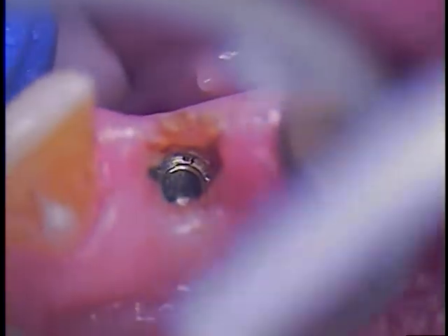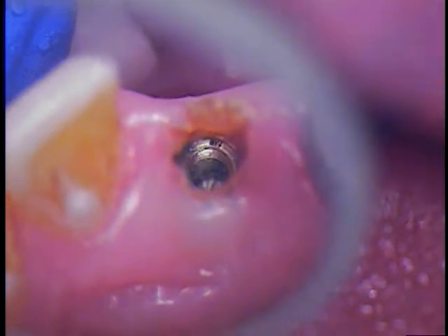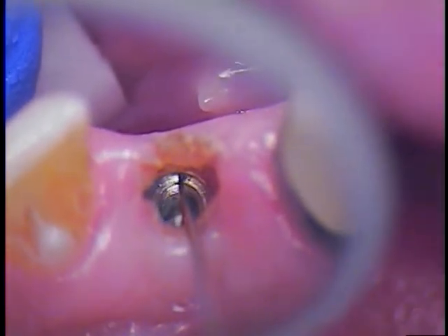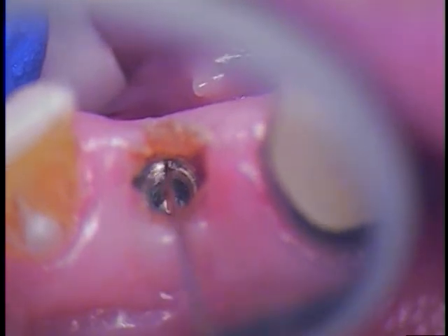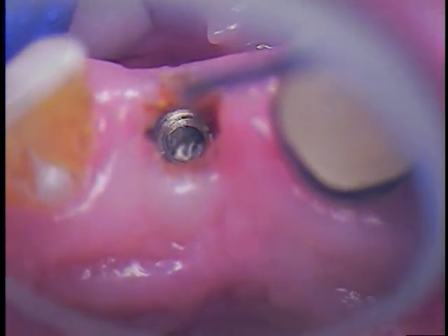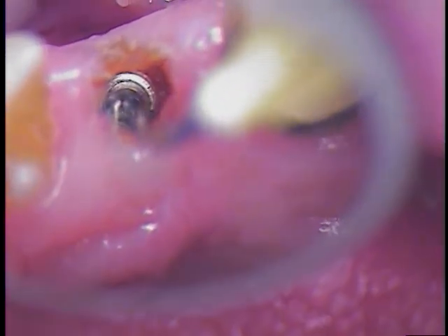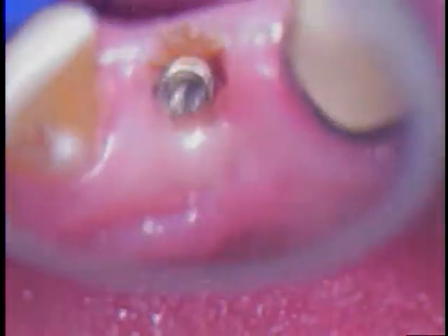Oh, a microsuction tip is in order. See, some debris on the lip inside. I'll get that in a second. Let's just see before I go in with the tip. Let's see if I can free that up. What is that? That's a remnant. Oh, it's metal. So that was a little bit of metal flaking off the rim. Good, we'll suck that out. That was metal hanging out there. Tiny bit. I'm not on. Lost power. New tip then.